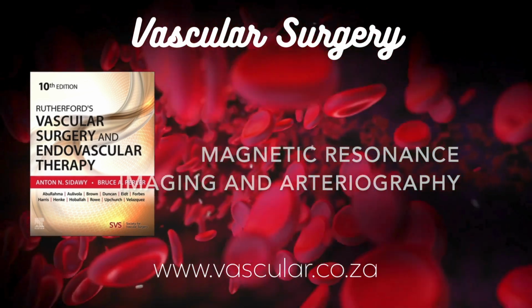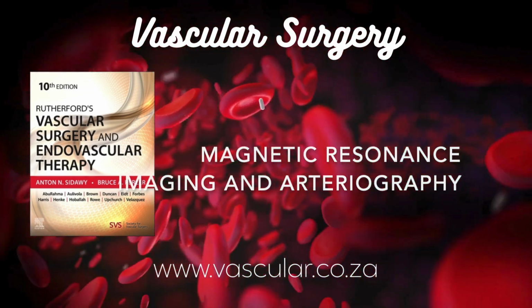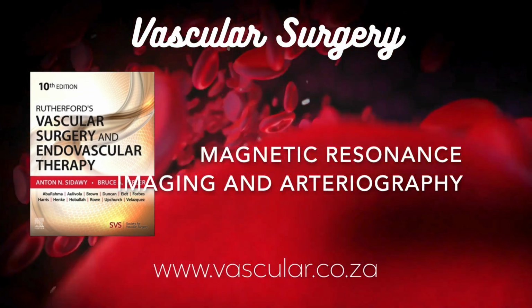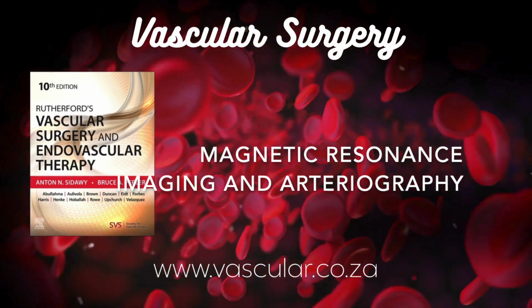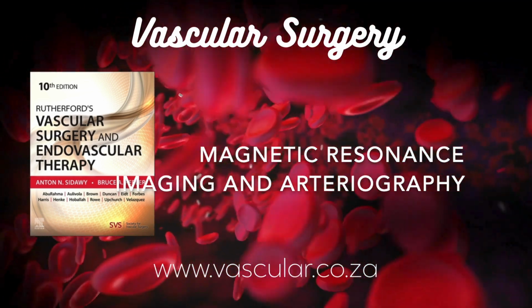Yeah, multiple small coil elements working together. For really small vessels, like in the hands or feet, we might use small, high-resolution local coils. Sometimes even a head coil can work well. And these multi-channel coils enable something called parallel imaging. How does that speed things up?